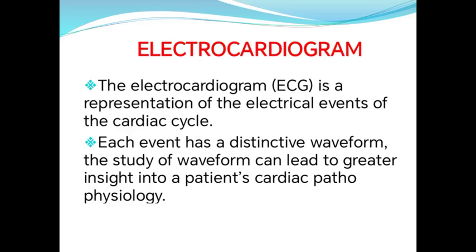What is the electrocardiogram? It is a simple representation of the electrical event or activity of the cardiac cycle. Each event has a distinctive waveform. So the hallmark of the ECG is the waveform. The study of this waveform can lead to greater insight into the patient's cardiac pathophysiology.